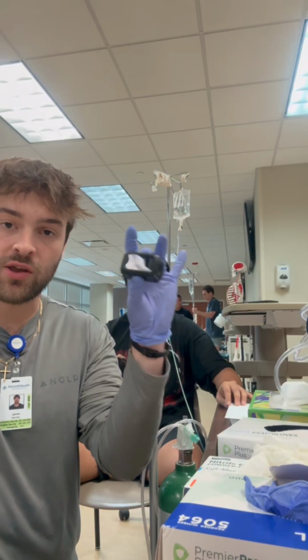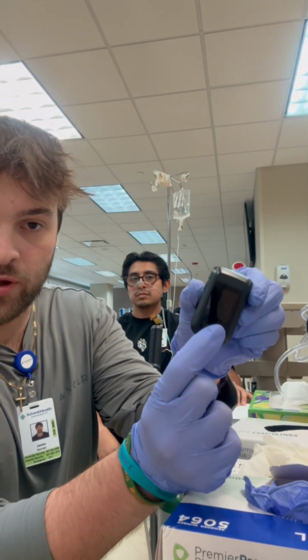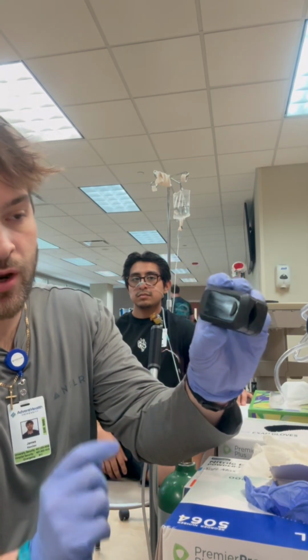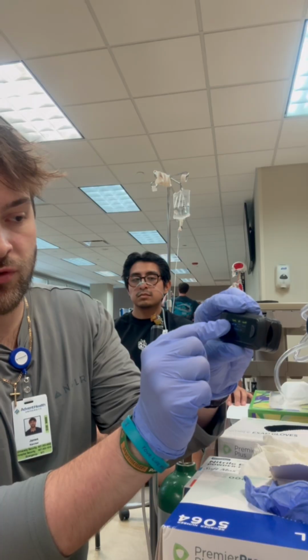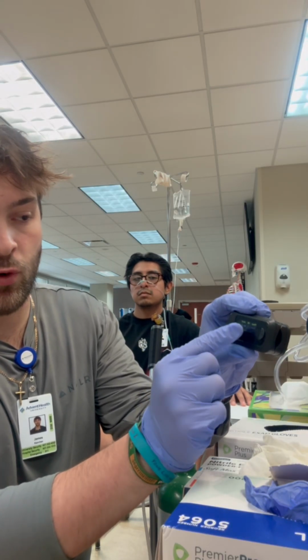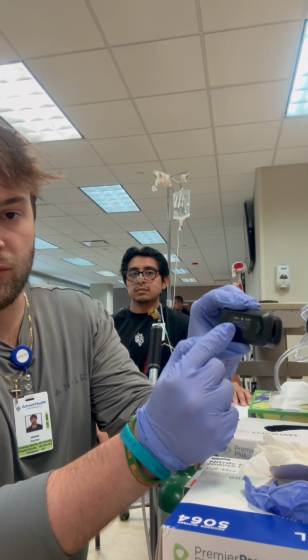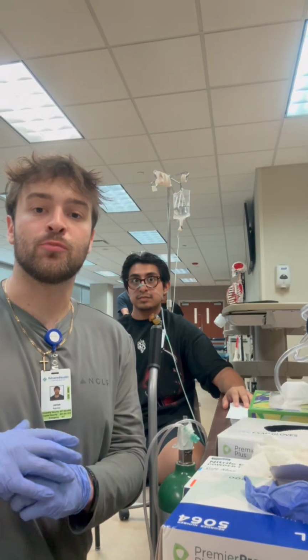This right here is called a pulse oximeter that we have talked about. To turn it on, there is a button right here for the power, which will turn it on and display a screen with the O2 saturation levels in the top left corner and the BPM for the pulse rate in the top right corner. And right here in the middle of the screen is where the numbers are going to be displayed. Now the next step is to put it on correctly.